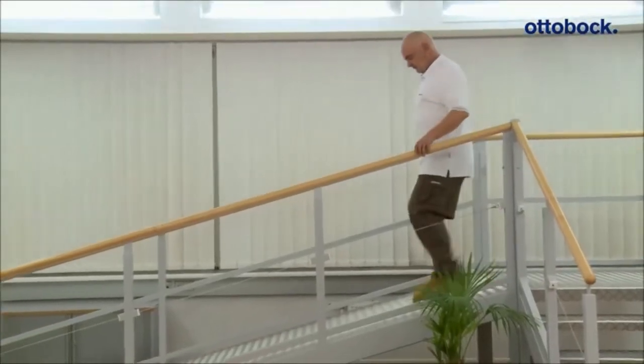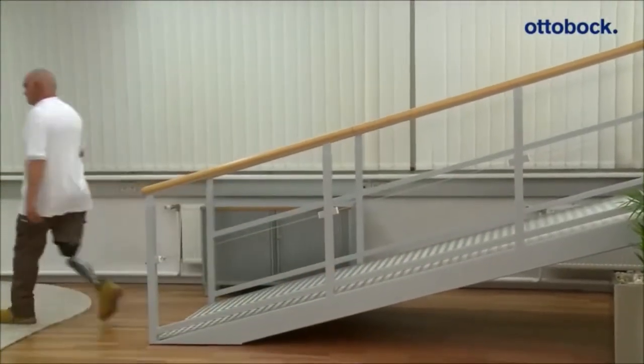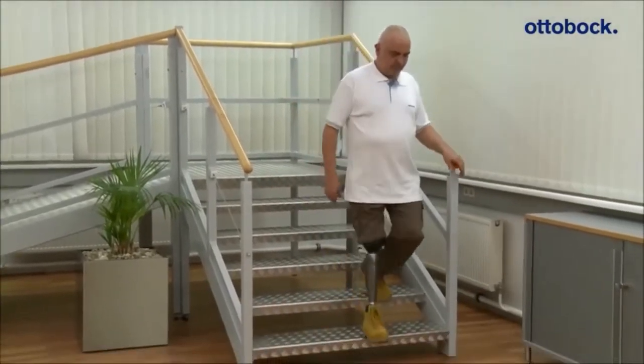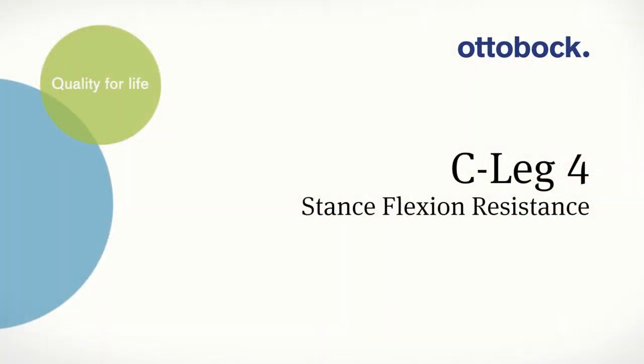Finally, the value has to be checked while walking down a ramp. Here too, the value can be adjusted if necessary. The final adjusted stance flexion resistance must offer the patient a satisfactory level of support in all three situations.